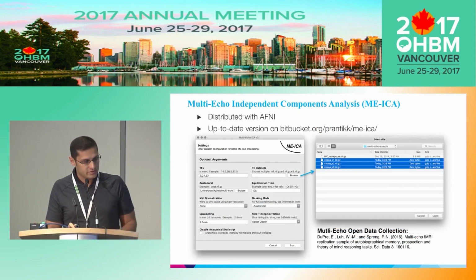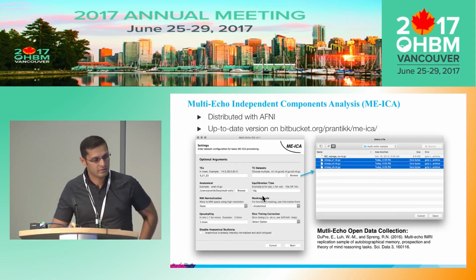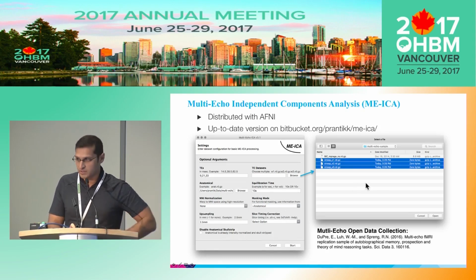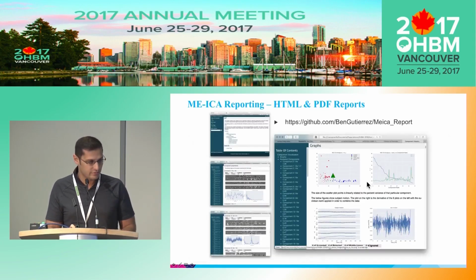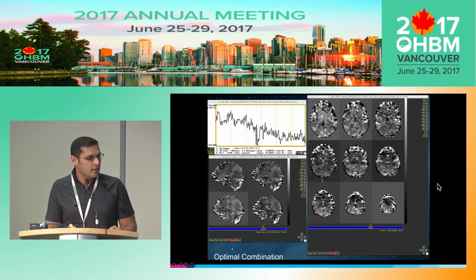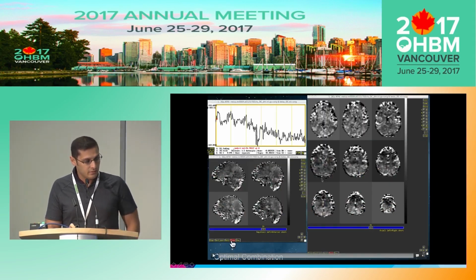There's a graphical user interface, which is available on this website. So you basically punch in your TEs, your data sets, your anatomical, you hit start, and it basically does the process that I mentioned before. There's also a report generation capability. I'm going to skip over this for lack of time, but I'm just going to show you a video.